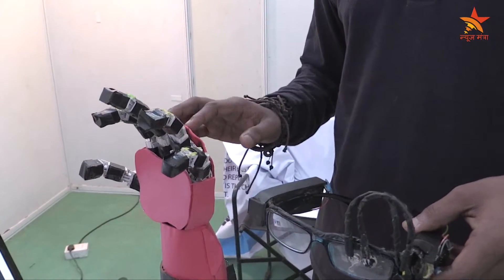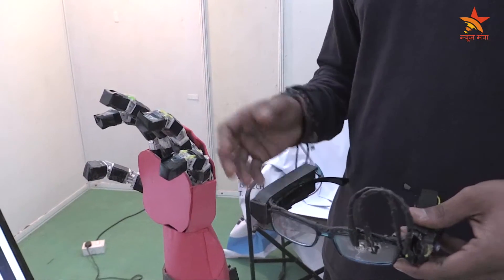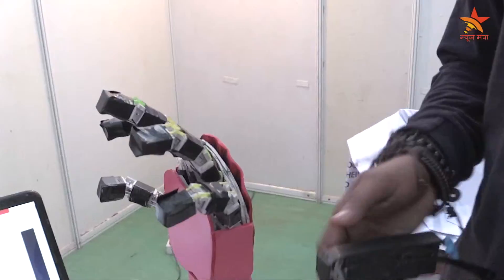The main motto of this project is to reduce the cost of the Bionic Hand to the maximum extent, so that middle class amputee people will get benefit out of it. The cost of the Bionic Hand is about only 7000 rupees. This is what my project is all about.